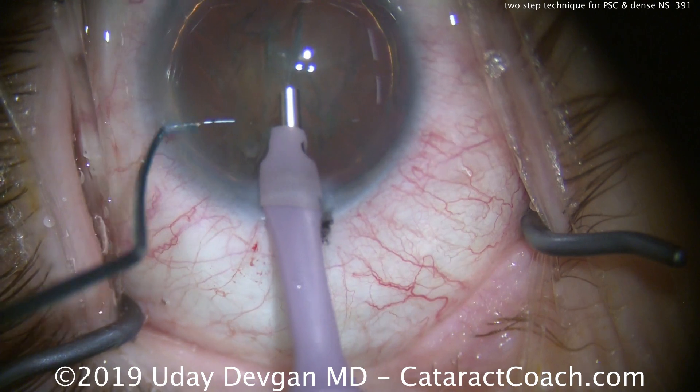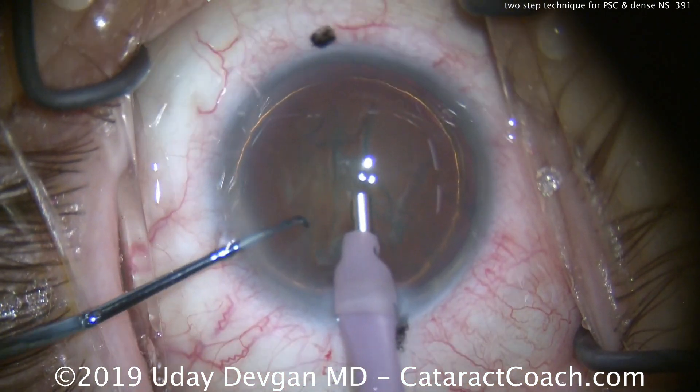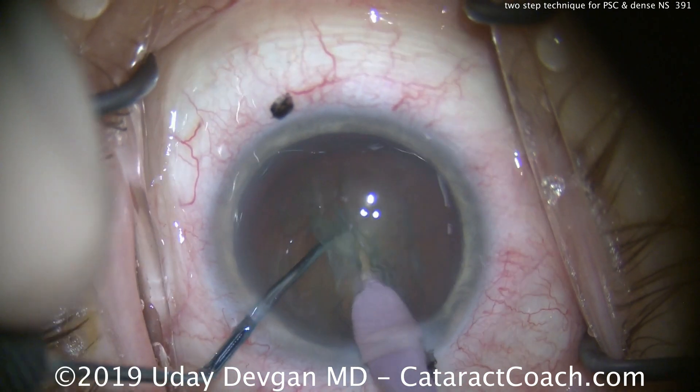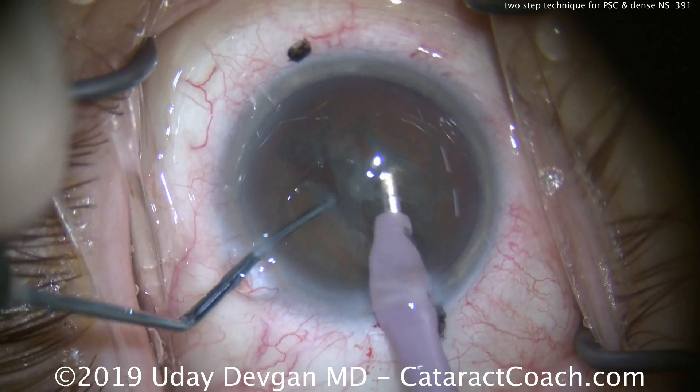The phaco probe is going into the eye, here comes the chopper. We buzz in with the phaco probe, put the chopper in, bring them together and apart — and there you go, split into two halves.